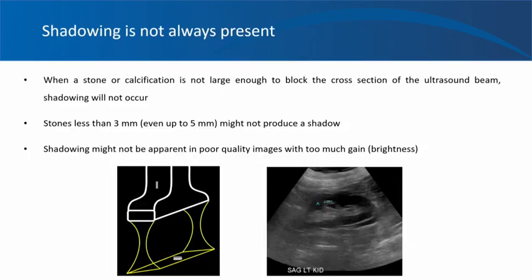Note that shadowing is not always present. Stones create shadow when they are large enough to block the ultrasound beam. But when a stone or calcification is smaller than the cross-section of the ultrasound beam, shadowing will not occur. Stones less than 3 millimeters, and sometimes even up to 5 millimeters, might not produce a shadow. Shadowing might also not be apparent in poor quality ultrasound images with too much gain. In this image you can see a hyperechoic structure in the kidney which appears like a stone but there is no shadow, leaving the question of whether it is sinus fat or a stone.